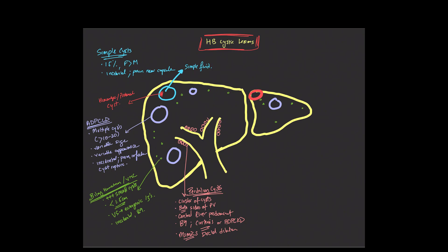Here we have an isolated cyst in the left hepatic lobe, specifically somewhat subcapsular location and in segment four. And when you see this entity of this isolated cyst, subcapsular, segment four, one of the things that you need to think about is this really uncommon entity called ciliated hepatic foregut cyst.